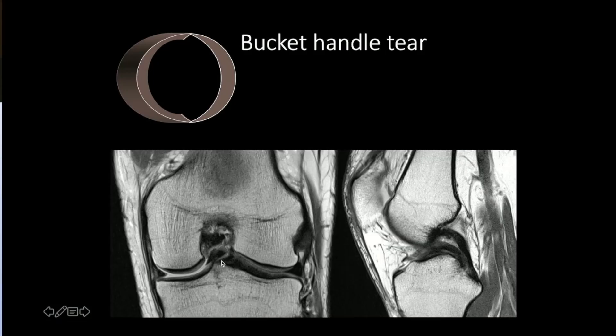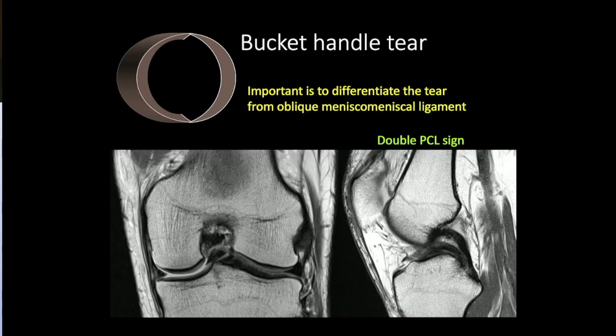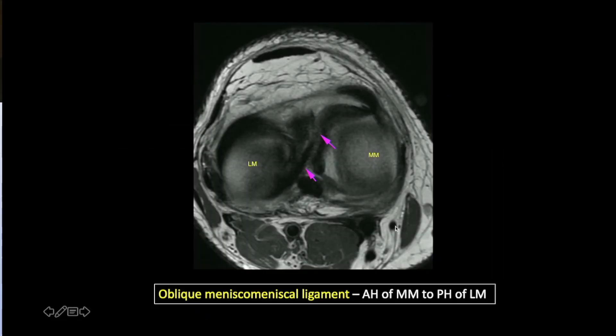In a bucket handle tear, a large longitudinal tear flips inside and, like a handle of a bucket, gets stuck in the notch because it's very difficult to return to its original position. Always remember to differentiate this from an oblique meniscomeniscal ligament, which is a normal variant. If you mistake the two, the patient will undergo unnecessary surgery. The oblique meniscomeniscal ligament runs from the anterior horn of the medial meniscus to the posterior horn of the lateral meniscus.